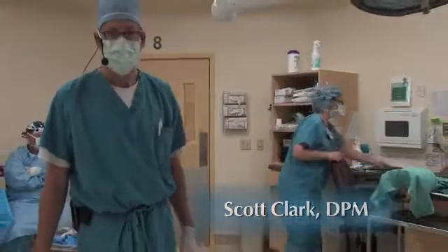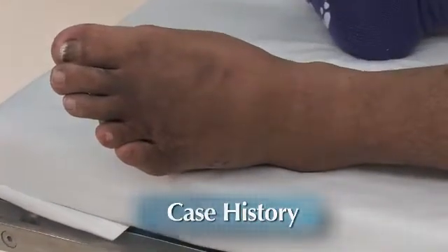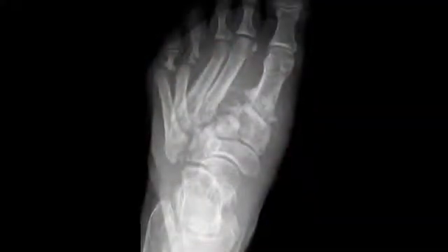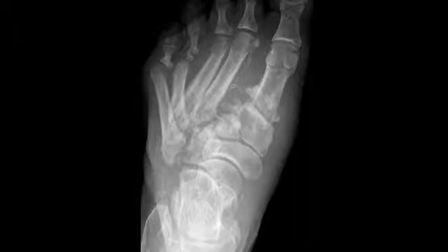So this is a type 2 diabetic with peripheral neuropathy. He's had this for greater than 15 years. He's had a recent fracture dislocation of his midfoot. This is an AP x-ray. You can actually see the lateral disposition of the lesser metatarsals, the destruction of the cuneiforms in the midfoot, and also the medial distraction of the medial column.